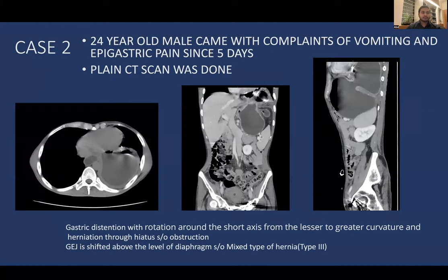Case 2: A 24-year-old male presented with vomiting and epigastric pain for 5 days. Plain chest CT including the abdomen shows gastric distension with rotation around the short axis from lesser to greater curvature and herniation through the hiatus, indicating obstruction. The G-junction is shifted above the level of the diaphragm, suggestive of a mixed type hernia in which the G-junction and part of the stomach are herniated.